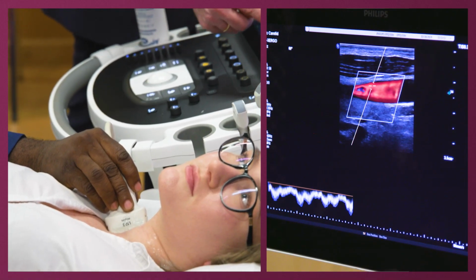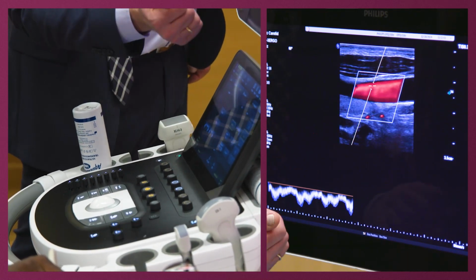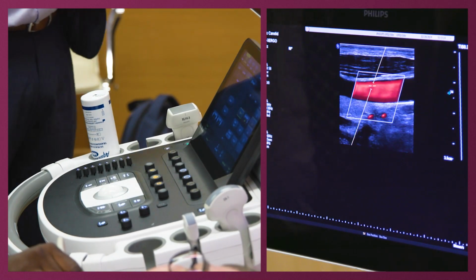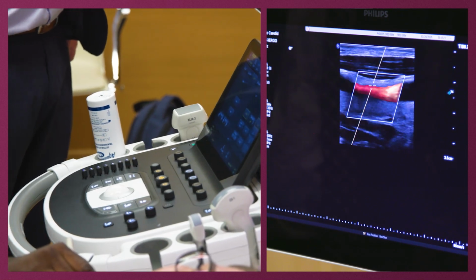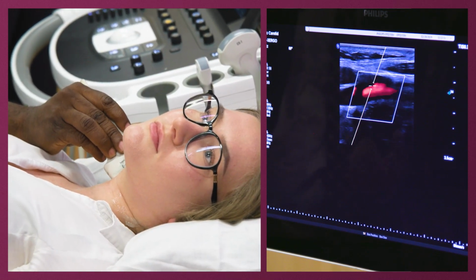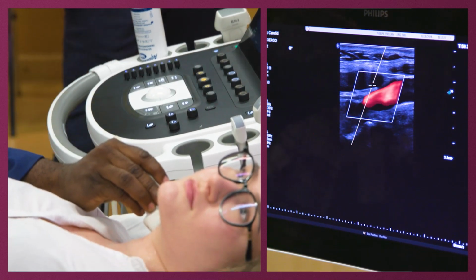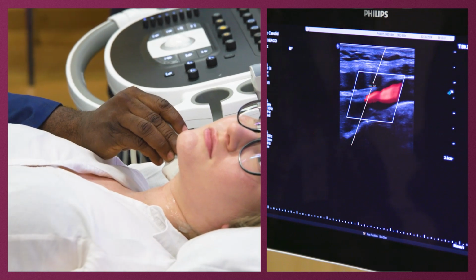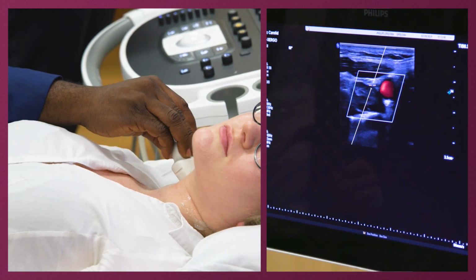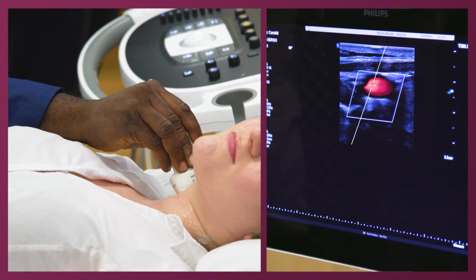You see these possibilities here. You can choose if you want to prioritize the image or the curve. And there's this one. I always use max view now. Okay, move towards the head. Okay, something is happening here. A little bit higher. Stop. And here, now you need to turn it like the arms on a clock a little bit. You have to, exactly, and see if you can identify one. That's too much. Just 3 to 5 degrees.